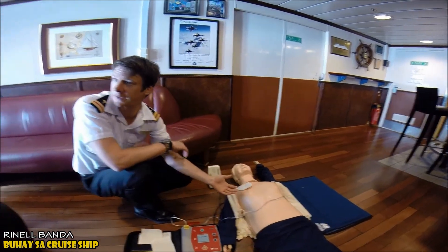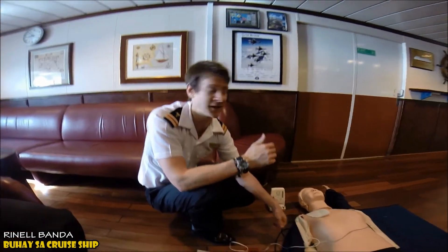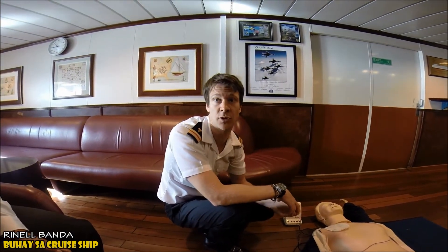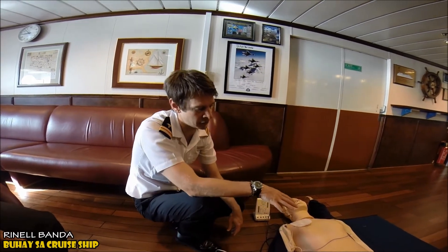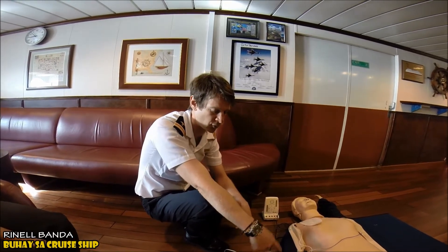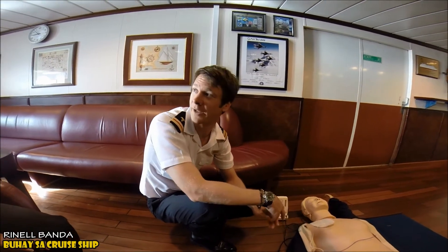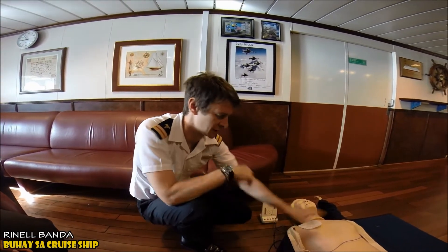To know if we need to continue CPR, we look for the same signs as before: are they breathing, are they responsive, are they moving around and talking? If not, get back on the chest and keep pushing. Once the AED is turned on, leave it on. It will give us a two-minute cycle of CPR and then prompt whether to shock again. Keep going until medical help arrives.